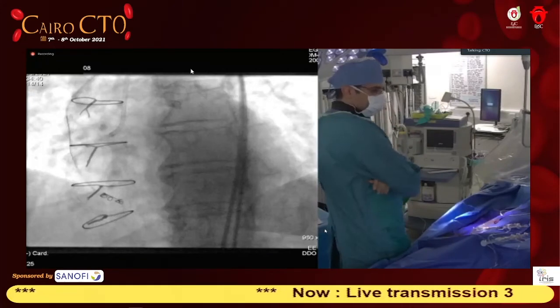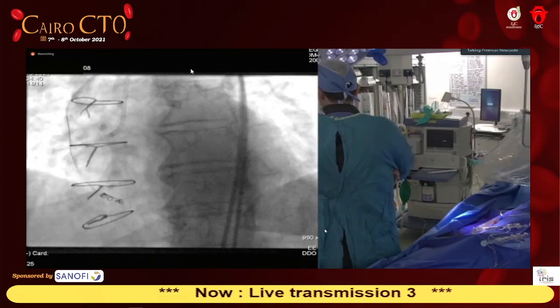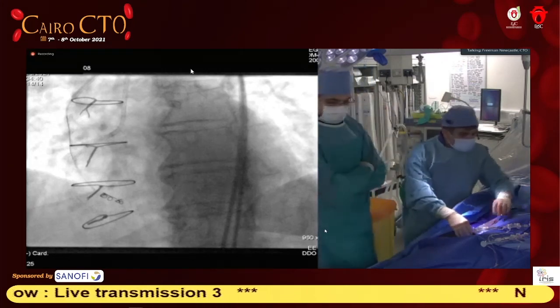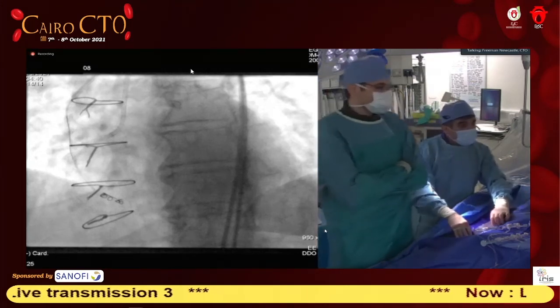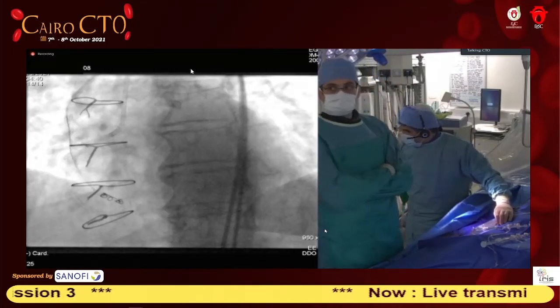So we have 5 minutes to go, Mohammed. Okay, yes. We're almost finished here. Turn it around, because it's time. I'll take the 6. We'll be done in here with 6 by 6, and I'll do an 8 by 8 of the RCA, and then we'll be done. Congratulations for this great case, it's fantastic, Mohammed.